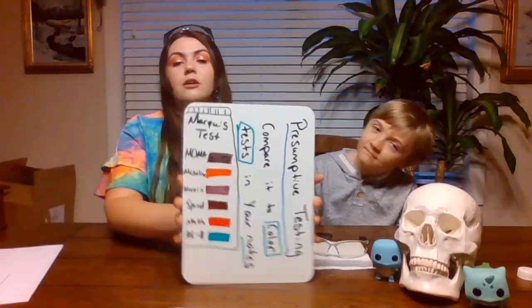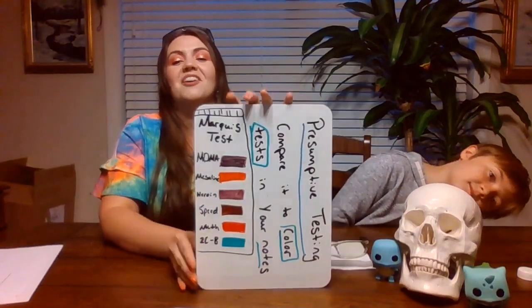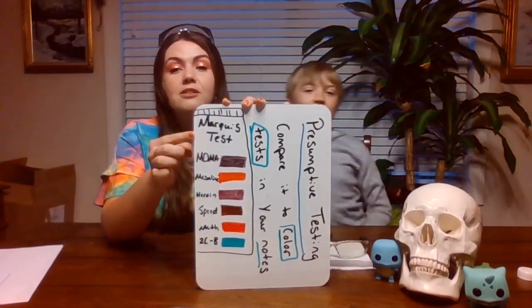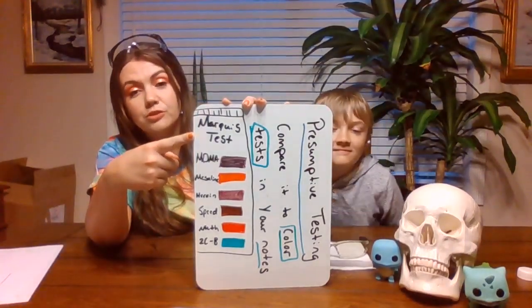So here's a quick example of a badly drawn Marquis test right here. A Marquis test is an example of a presumptive color test.